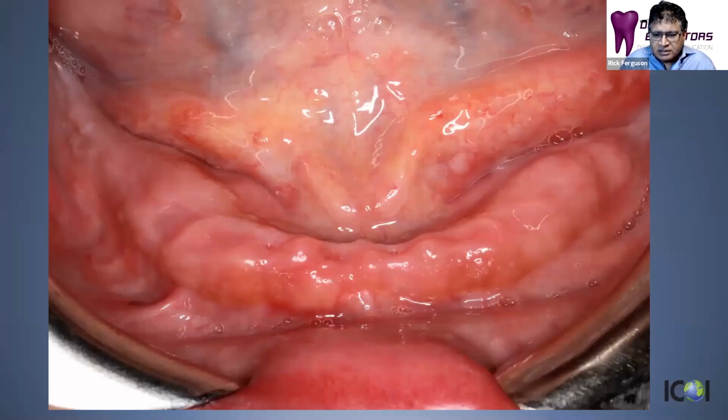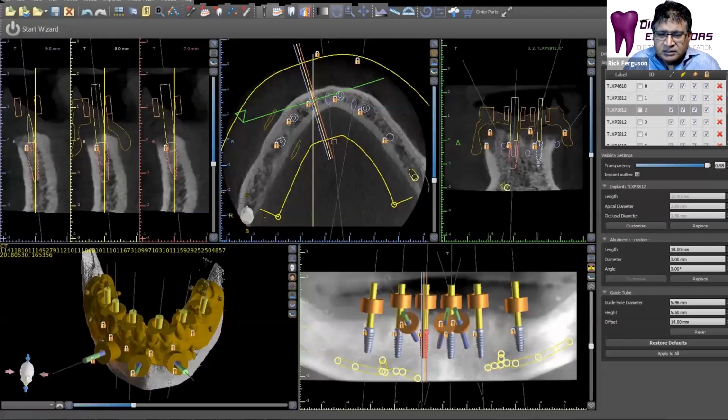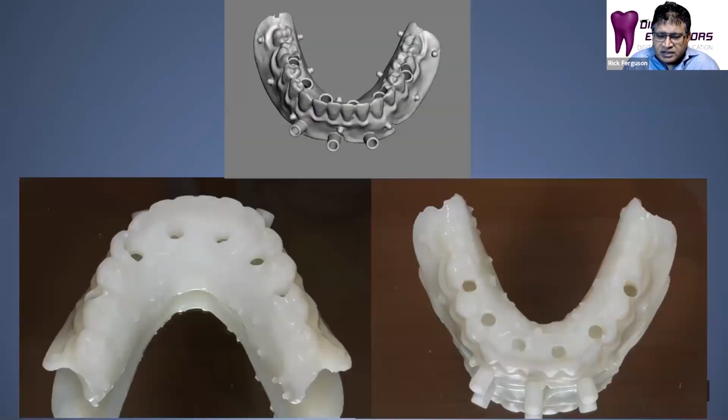So let's look at an edentulous case, a lower edentulous case. This is Ernie. He's 46 years old and suffered from advanced periodontal disease, and all his teeth had to be removed. And now he has a set of dentures. So we did the denture technique again for him in lower. And in this case, we decided to do immediate load. So what we did here, and you'll see what we're doing, this is a case that's about 2 years old. I actually no longer use this technique because we've evolved, and I'll show you a case I did just last week, how we've advanced even to do this type of case as well.